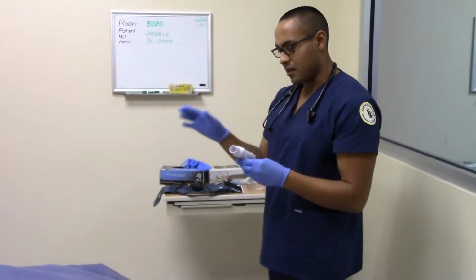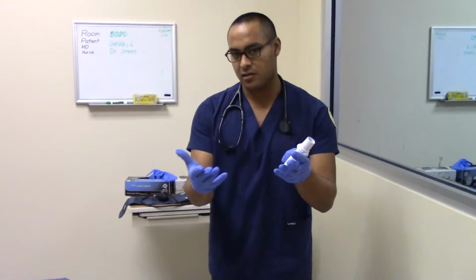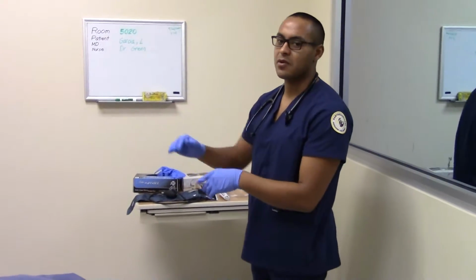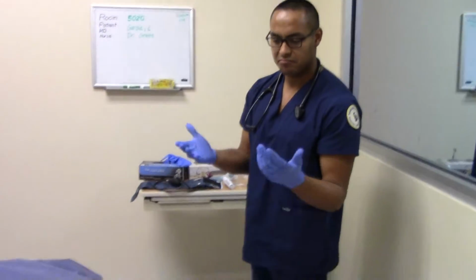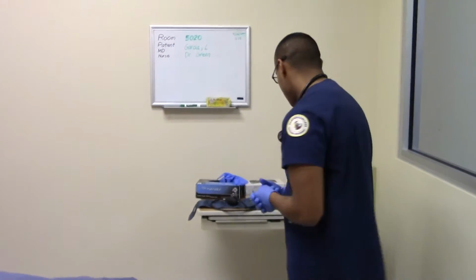So now I took the peak flow meter. Now I'm going to do the SVN. Hopefully the number increases. Pulse ox on his hand because I want to see where his heart rate's at and then his saturation. Heart rate should go up. Medication increases the heart contractility.